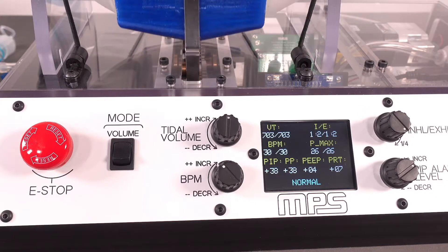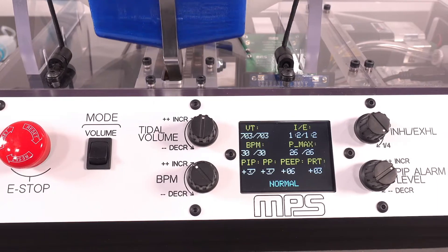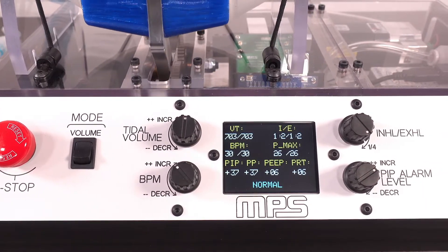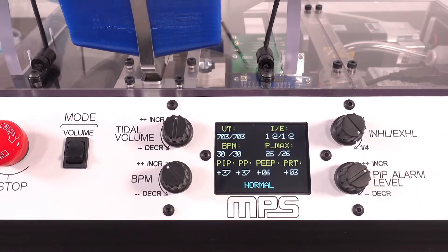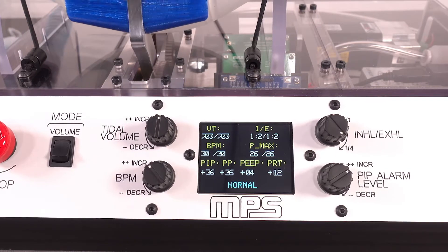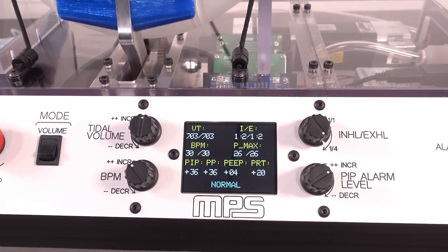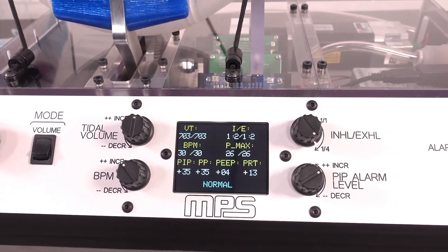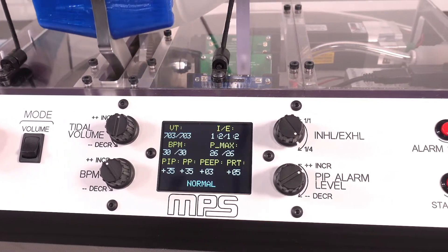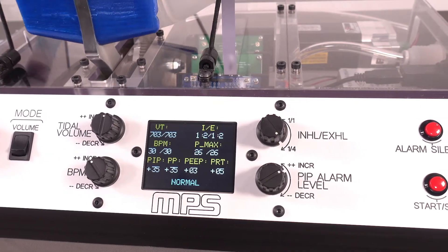The system operates in volume control mode while monitoring the pressure for any alarm conditions. The operational range can vary the tidal volume delivered, the breathing rate, and the inhale to exhale time ratio of each breath. Each setting is displayed and controlled on the front panel.